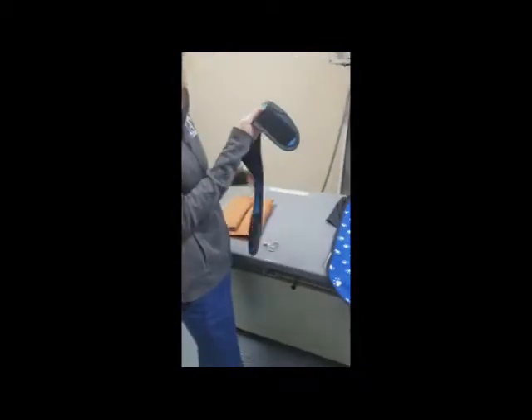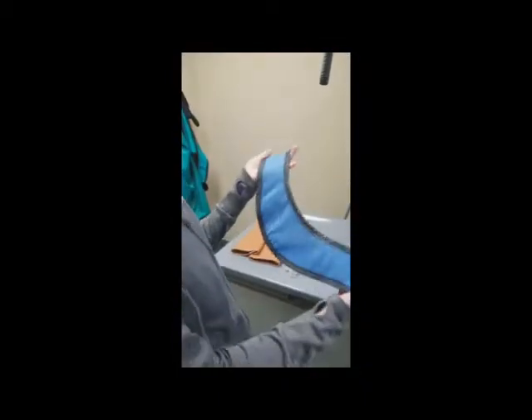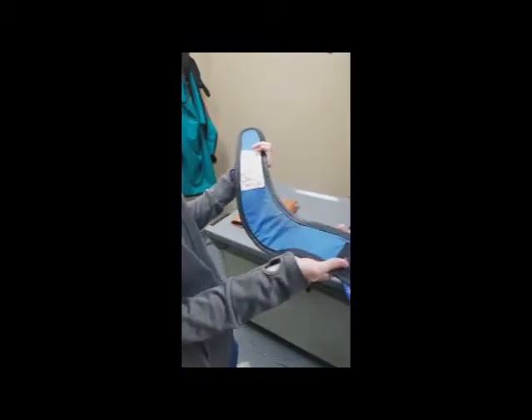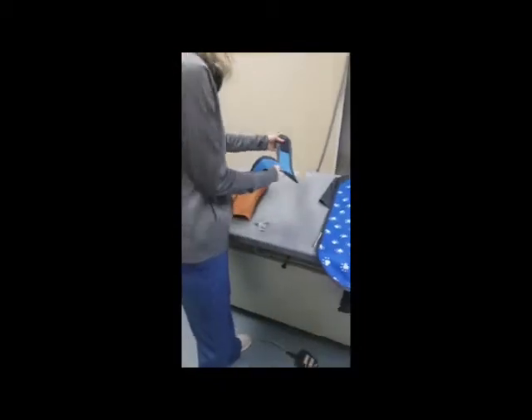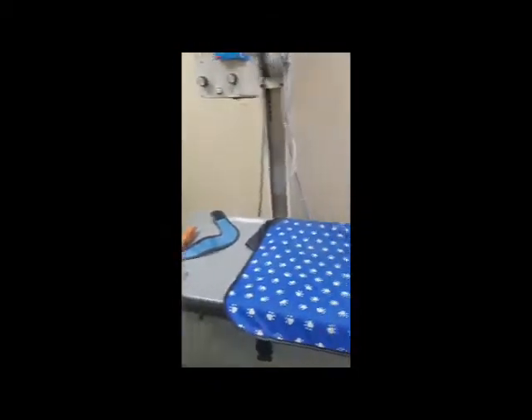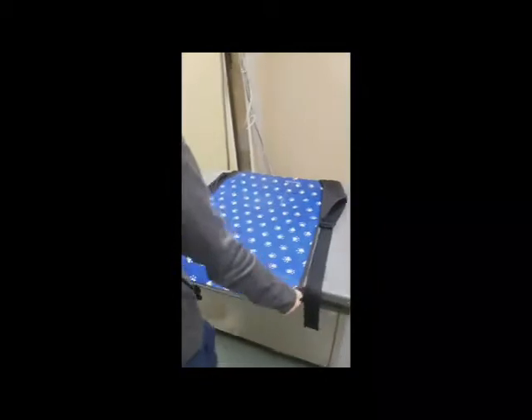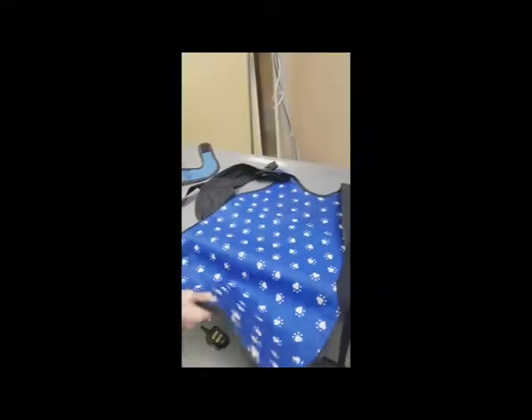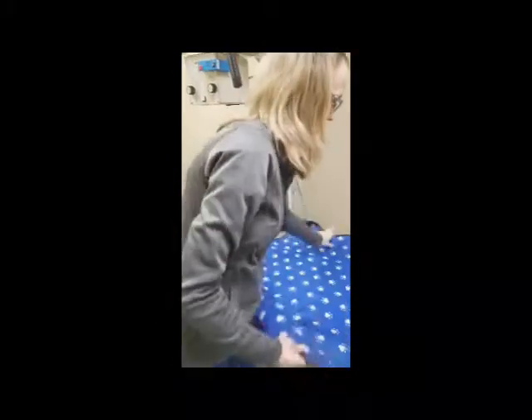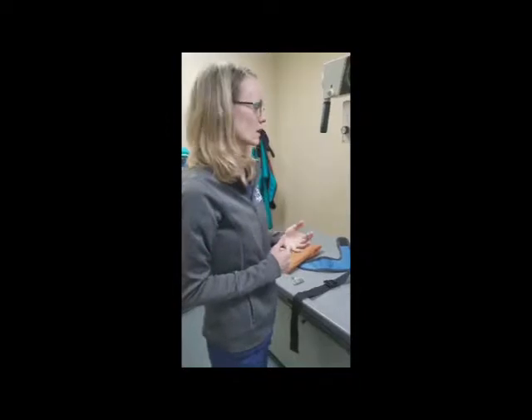This is your thyroid collar. Same thing — you want to look for any cracks, scratches, or bite marks, anything that would make it unusable. That looks okay. This is your lead-lined gown — you're also going to inspect this one. I'm not seeing anything on it either. Another way to help protect yourself is to take x-rays of the PPE every six months to make sure there's nothing you're missing with the naked eye.